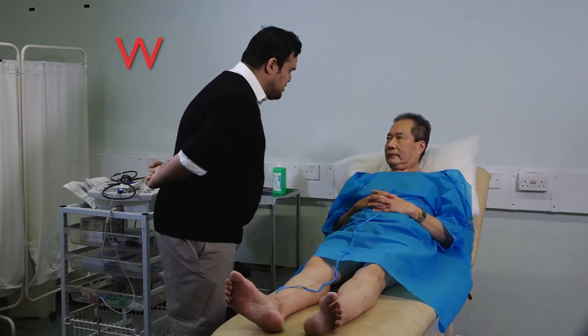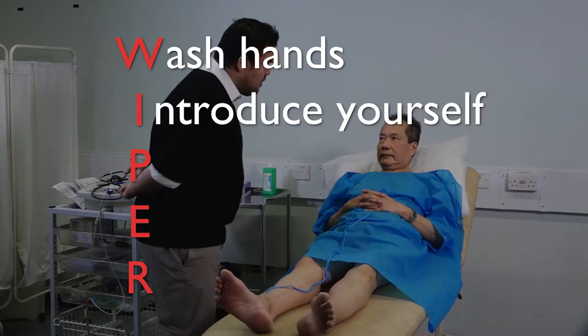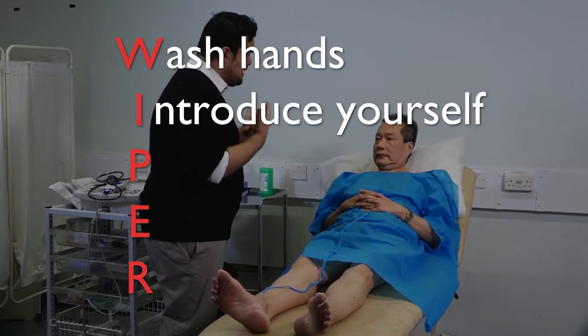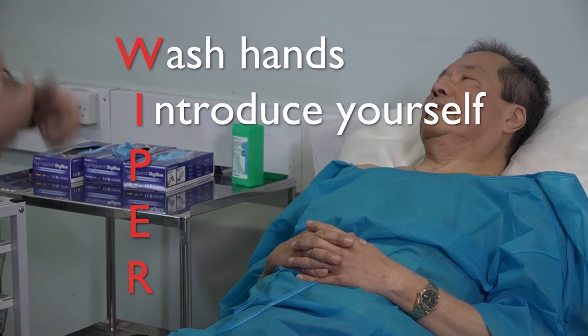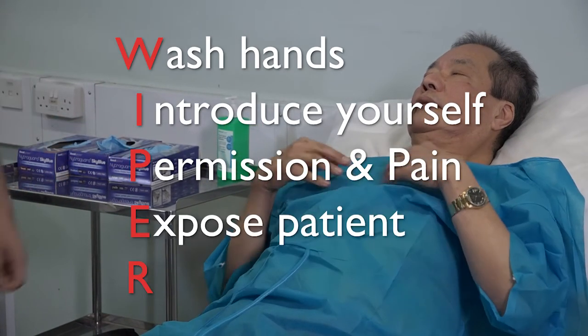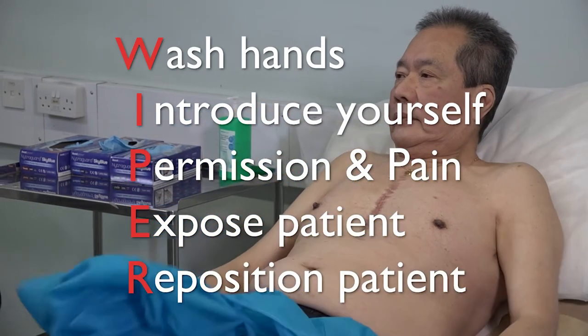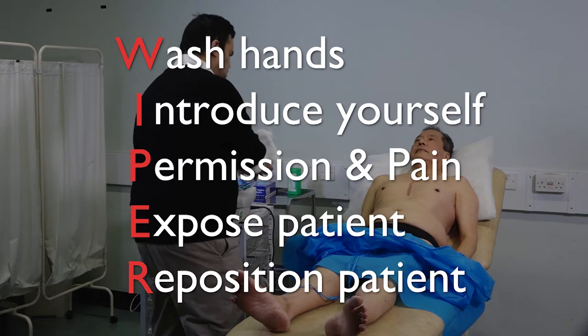To begin the procedure, wash your hands, introduce yourself to the patient, stating your full name and role. Ask permission and check if the patient is in any pain. Expose your patient appropriately and reposition them lying down at a 45-degree angle.